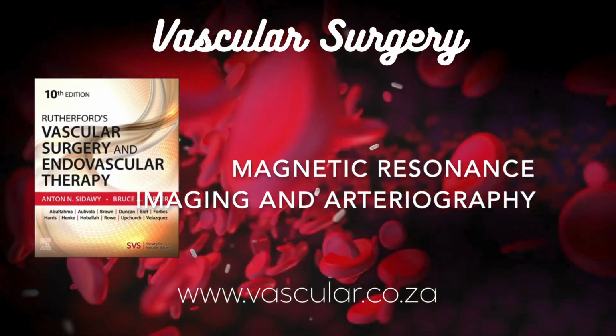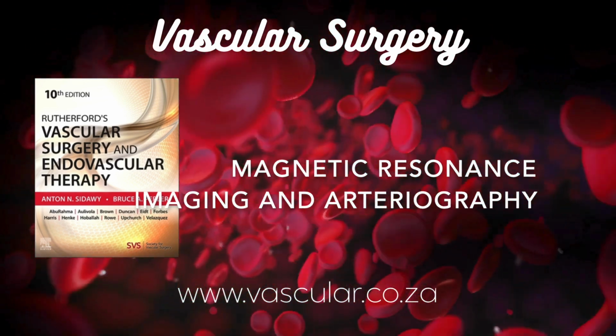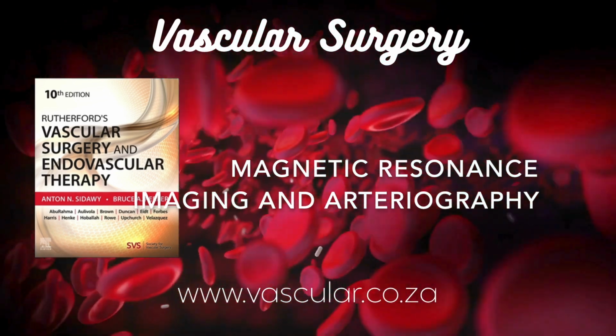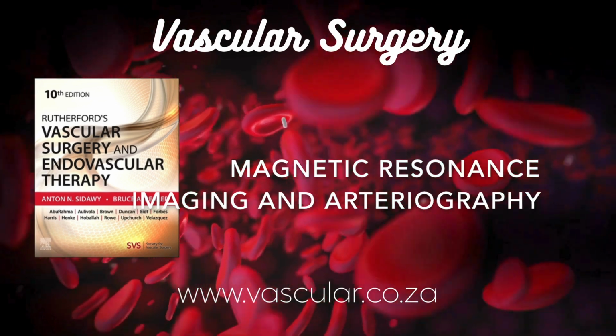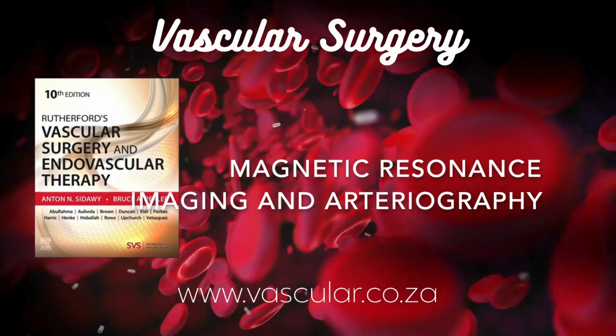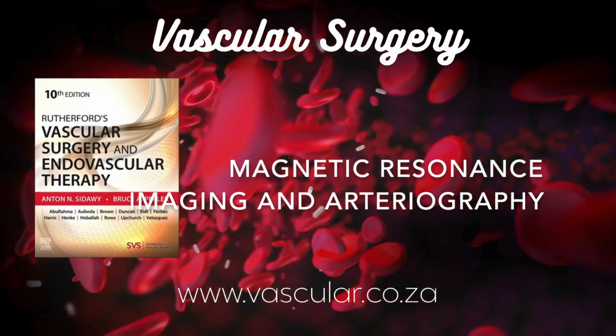It helps keep the veins darker while the arteries are bright, improving visualization. A neat little trick. Definitely. And lastly, after the scan, what about the software for looking at the images? A good post-processing workstation is non-negotiable. It absolutely has to have those MPR, MIP, and VR capabilities we talked about. Reformatting and 3D views. Yes, and often additional software tools are really helpful.